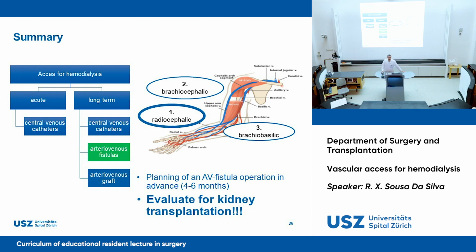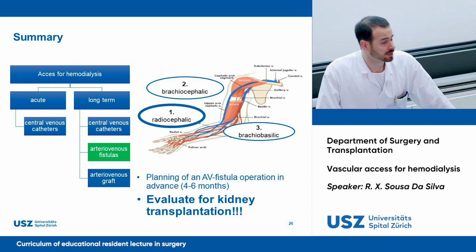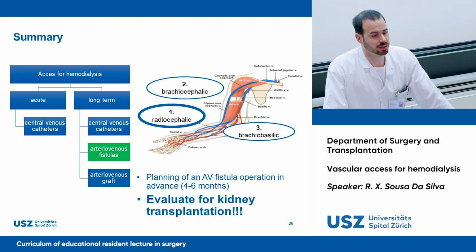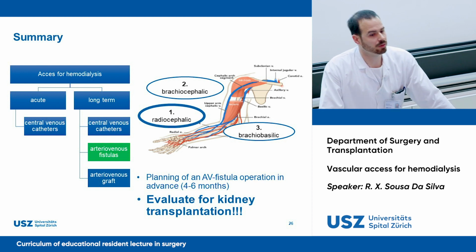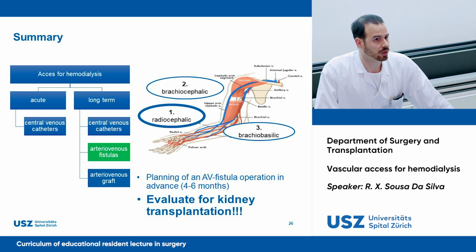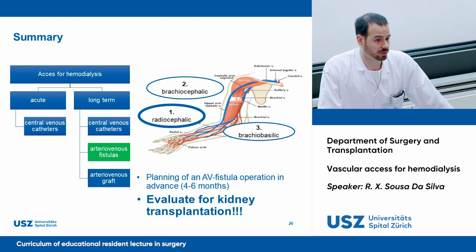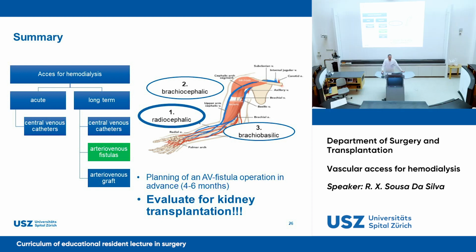Here I want to leave a statement from our department. For us, it's important that at least a transplant surgeon is involved or is performing the vascular access, since he would see the patient in a follow-up and always re-evaluate for a kidney transplantation. We are the only clinic in Switzerland where mainly or nearly exclusively transplant surgeons perform those fistulas.